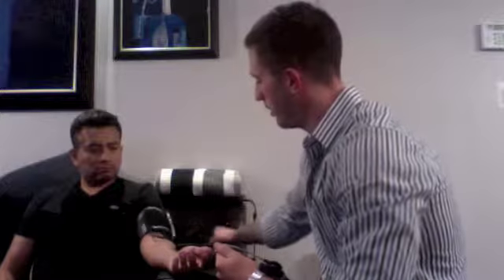So after doing that, I got 122 over 82, which is a little pre-hypertension because it's between 120 and 140. But if you get a reading like that, you can opt to do it again on the other side, or you can just ask him if he usually has high blood pressure or anything.